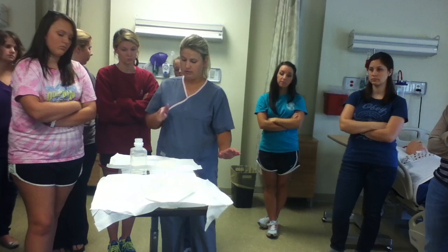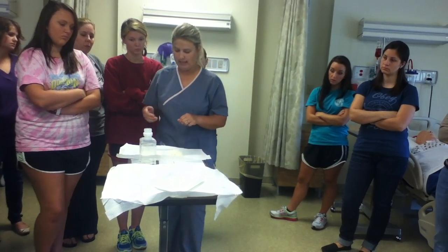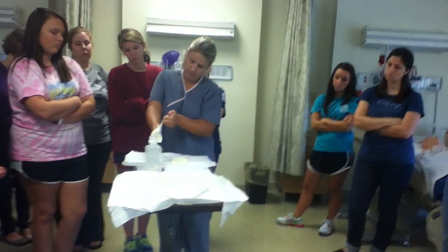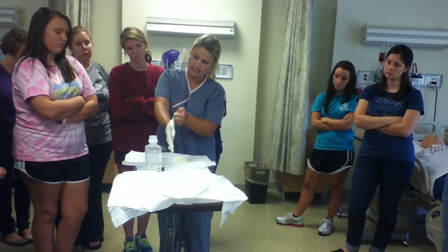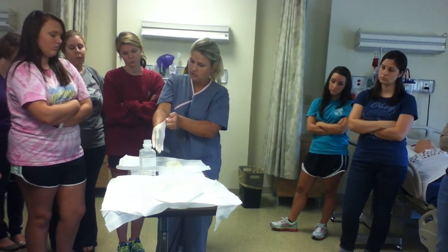We have 2 sterile fields. This is a sterile field, that is a sterile field. This sterile field still's got 1-inch borders too, guys. So now we're going to glove one hand. So I'm going to pick up my glove, and I'm going to glove my one hand. You guys, watch your fingers. You will put on your gloves and not realize it, and you're all over here, and then before you know it, you've touched. Keep it down towards the center or pick it up.